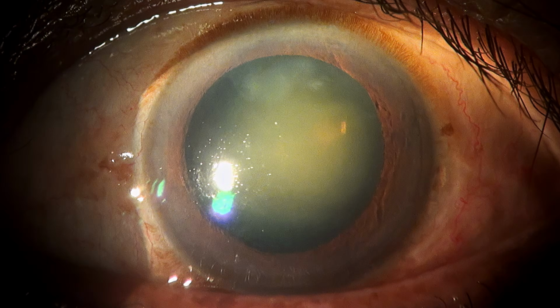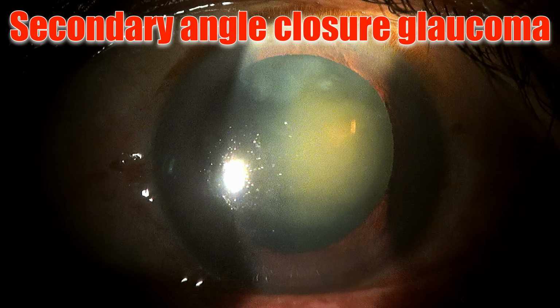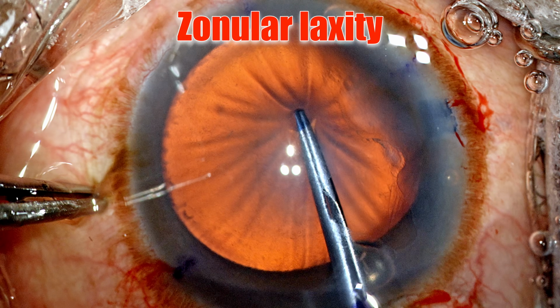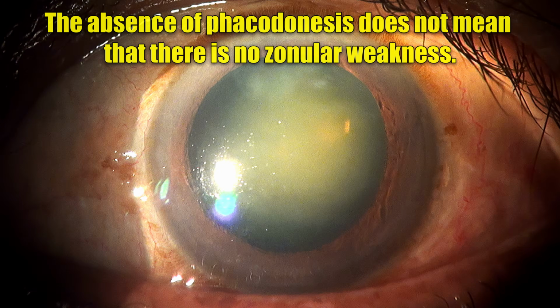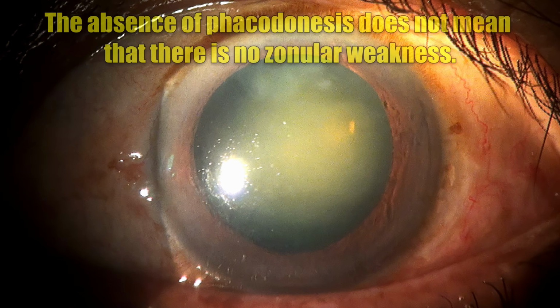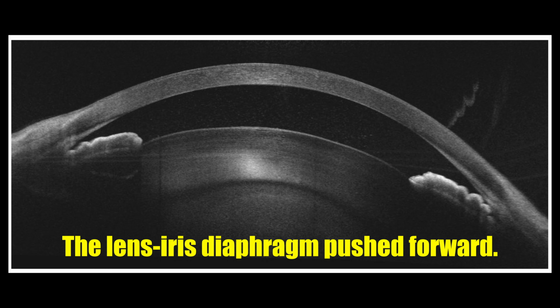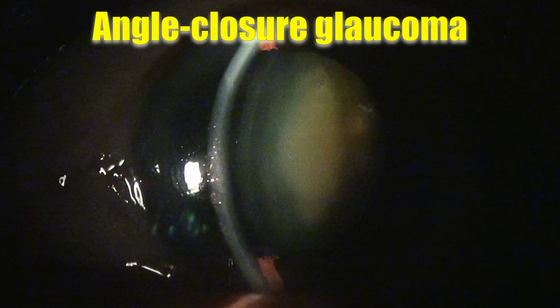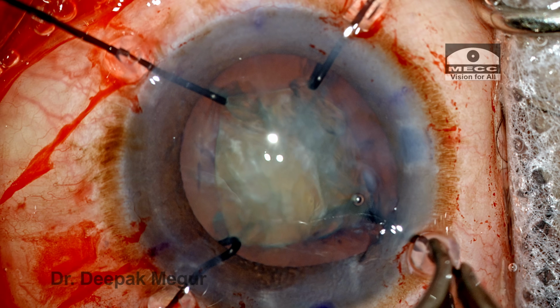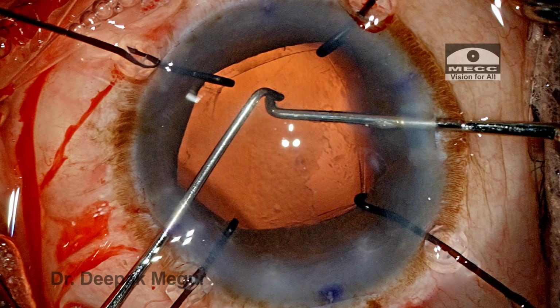To summarize, this was a very unusual case where we had an angle closure like disease, but it was secondary to the anterior displacement of the lens iris diaphragm because of zonular laxity. So a few lessons to learn from this case. Number 1, absence of phacodonesis does not mean that there cannot be zonular weakness. Number 2, lax zonules can push the lens iris diaphragm forward, resulting in an angle closure mechanism. And number 3, appropriate technique to stabilize the bag intraoperatively will ensure good outcomes.